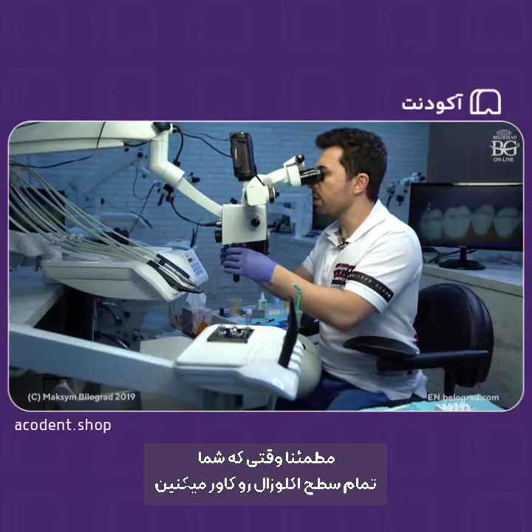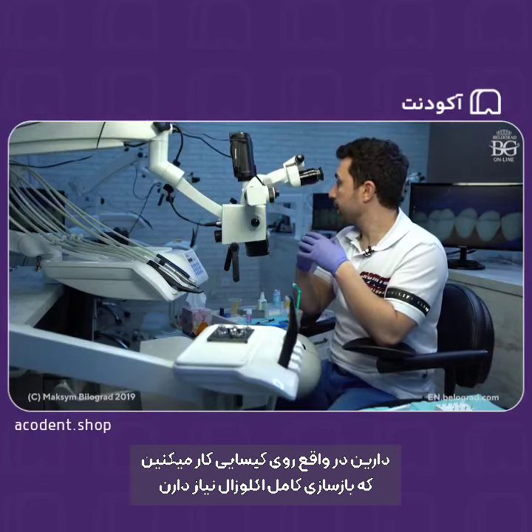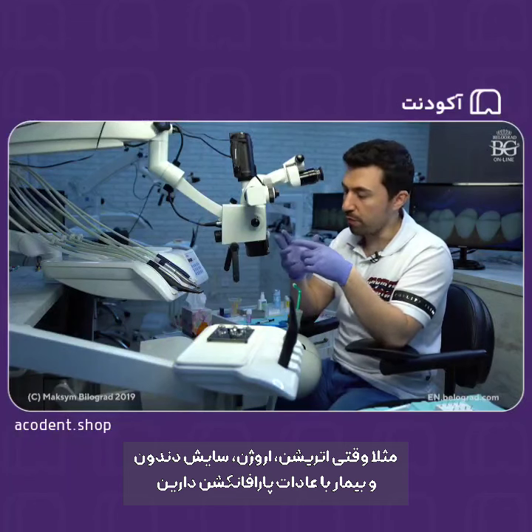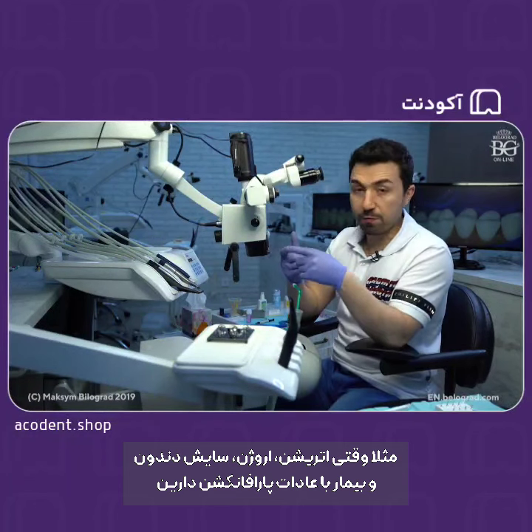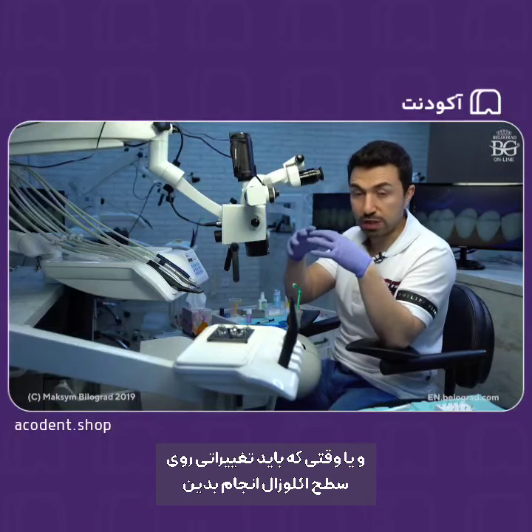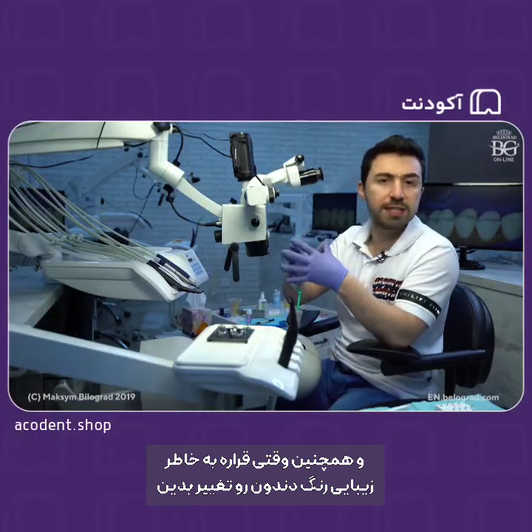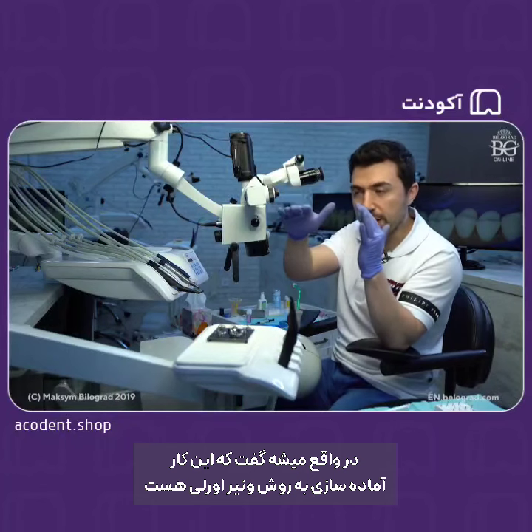And for sure, when you cover all the occlusal surface, these are the cases when you do a full molar rehab case. For example, you have attrition, erosion, tooth wear, parafunction, you need to raise the bite, you need to raise the VDO, and you need to do something on the occlusal area, and also you need to change the color because of the aesthetics. So basically this is veneer overlay preparation.